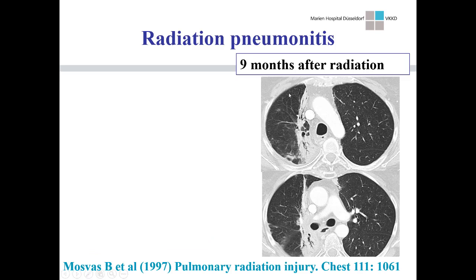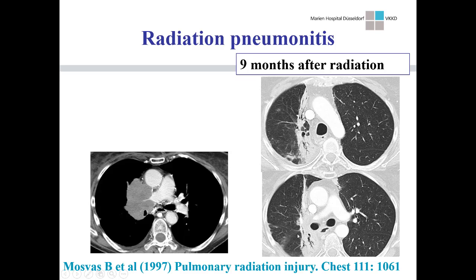Here is a similar case — the CT scan post-therapy in a patient with lung cancer shows very sharp borders crossing the anatomical borders. This is the pre-radiation scan in a patient with a central lung cancer, again treated with an AP-PA field.